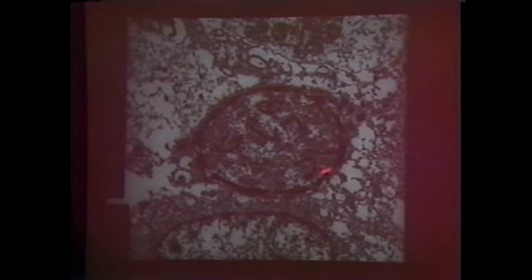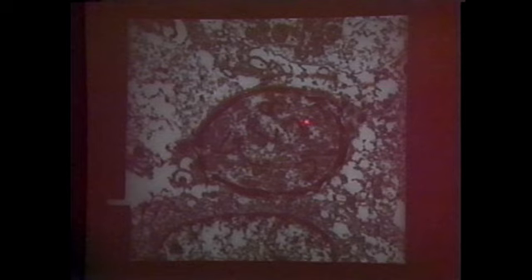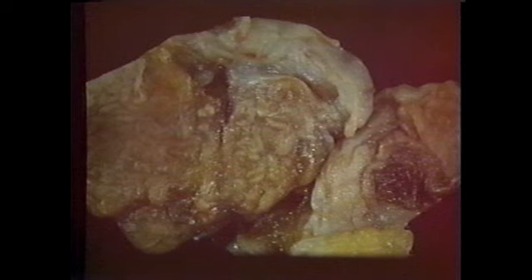So we had both the female, and this is the male, and unfortunately you really can't pick it up, but there are little flagellae in here for the microgametes, and this is a developing microgametocyte. So there's only been 12 cases of intranuclear coccidial infection. So this will soon be published. Another case that will soon be published, which I'm very interested in.